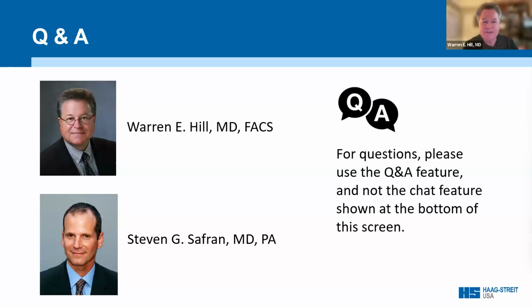Well, yeah, sure. That's a good question. So basically, is it an unstable tear film, or is there movement? Usually with movement, you're going to get image duplication, you'll get smearing, and the whole thing will be smeared. If it's an abnormal osmolarity, what you may get is some part of the ocular surface looks funny and other parts do not. So usually with ocular movement, all 48 of the images are going to look weird. That's the typical way you do it.